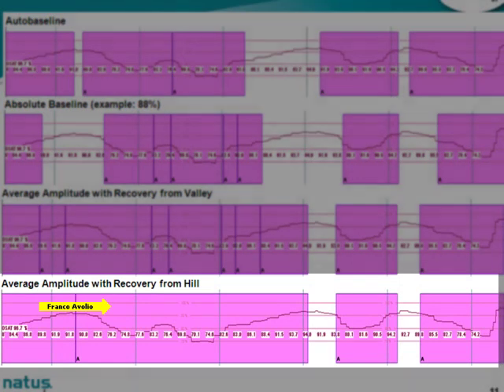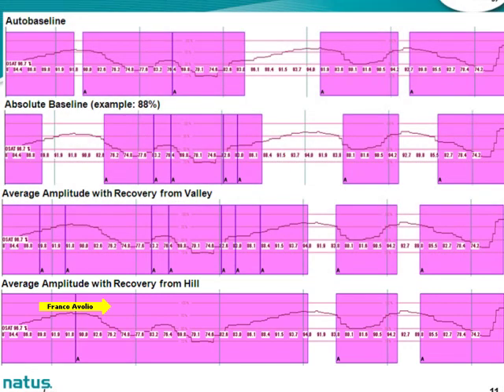Now, if you look at these samples here, and if I were to ask you which one do you think best captures how you would do this in the lab, when I've asked that question to other lab people, generally speaking, the most popular one is the auto baseline. Now, I don't think that the auto baseline is actually the default.